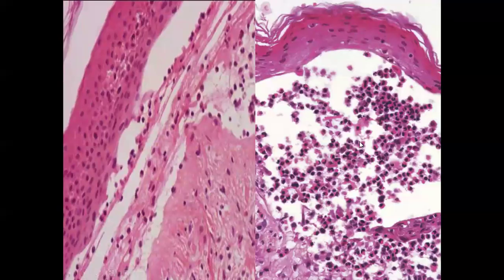And here you can see a large subepidermal blister. The epidermis is stretched out in the roof of the blister, and the blister cavity contains numerous eosinophils. So if we find eosinophils within the blister cavity, the first differential diagnosis is bullous pemphigoid, or herpes gestationis, which is the bullous pemphigoid occurring in pregnancy. This condition is also seen in inflammatory type of EBA.